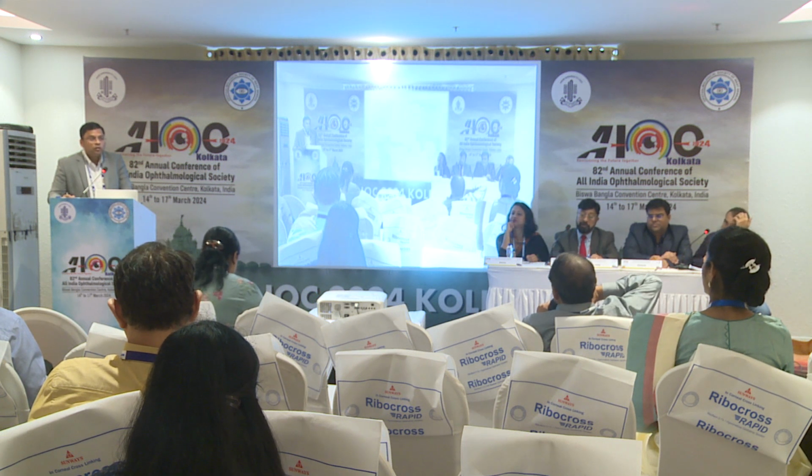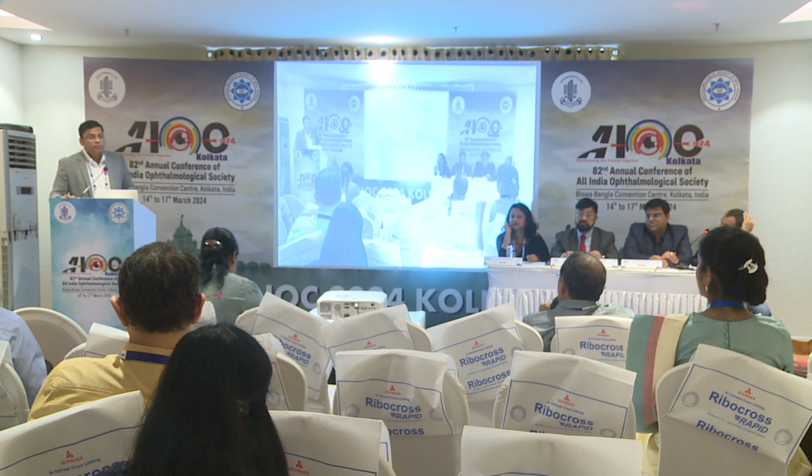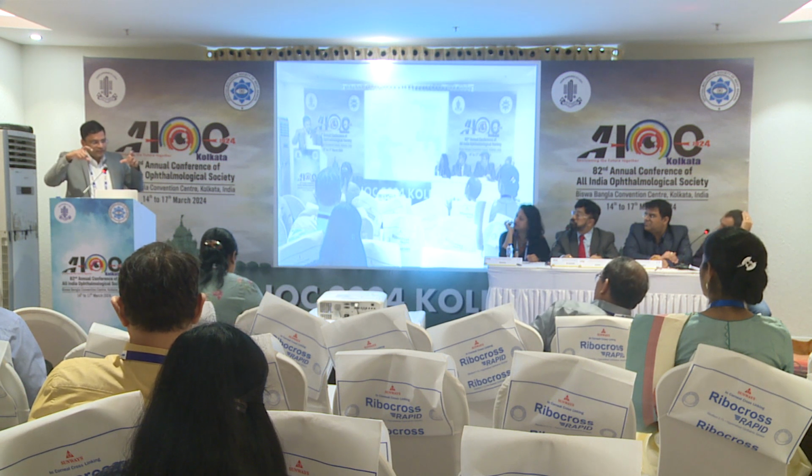Post-operatively, sir, he still had residual astigmatism. How much was it? 0.5. Okay, he still had that. The good thing was we could fix it at 4 points.